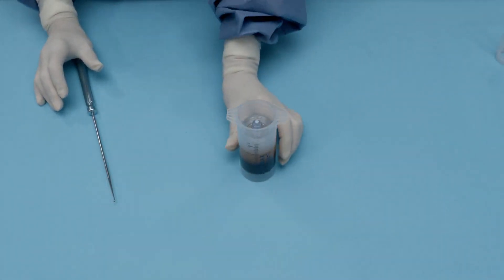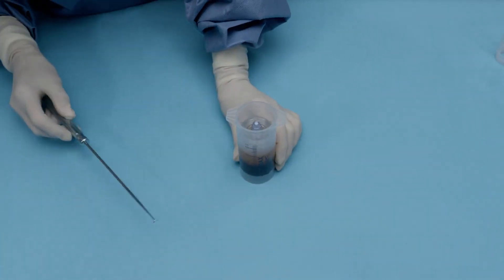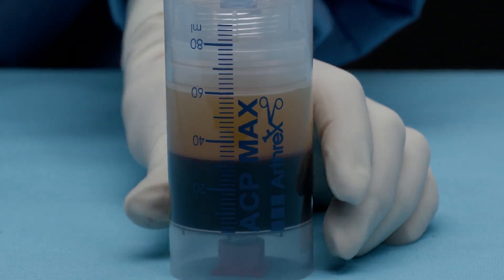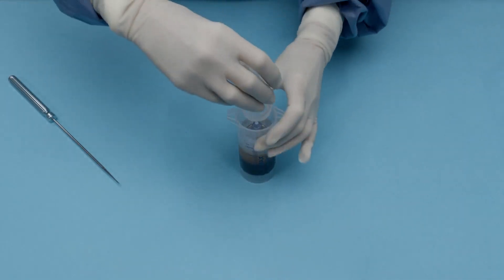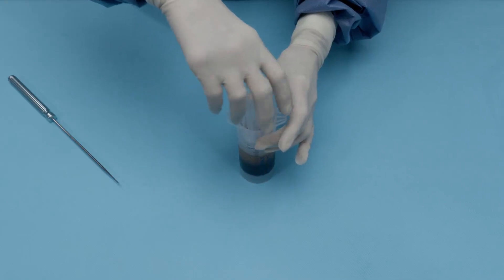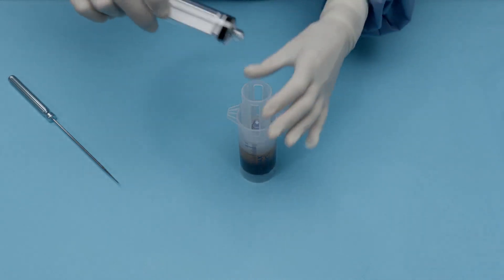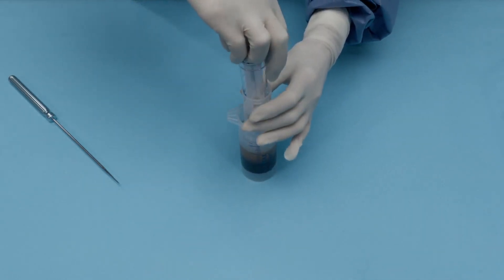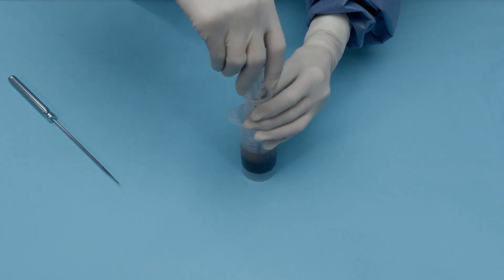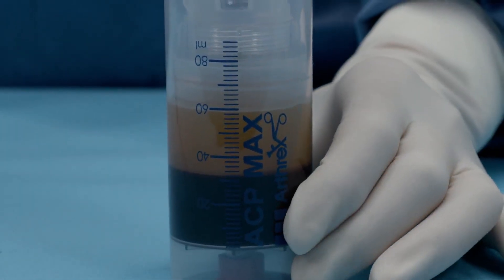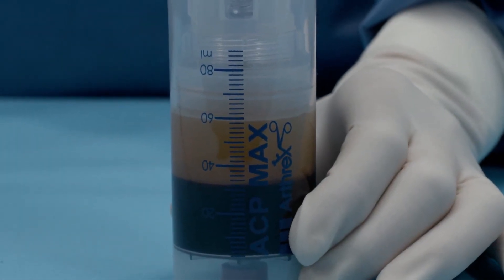After your first spin, you'll see in your ACP Max device a clear delineation between your platelet poor plasma, Buffy coat, and your RBC layer. We're going to replace the cage guide onto the ACP Max device. Then we're going to take one of the 30 cc syringes supplied in your kit and firmly seat it upon the needleless valve. And then we're ready to pull off our platelet poor plasma.